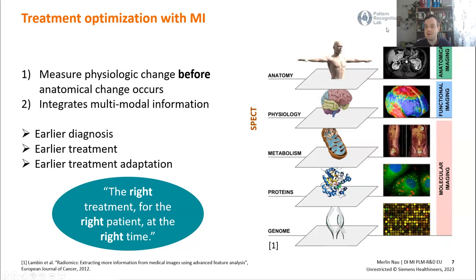And you can see a buildup of the imaging techniques here, where we have the anatomical imaging side, which is CT or MR, and then we have the physiology, and then somewhere between the physiology and the metabolism, we have SPECT and PET. Now, this was just a motivation of what all of this image reconstruction can be applied to, and that it actually is a crucial task for medical doctors, and it actually affects a lot of people.